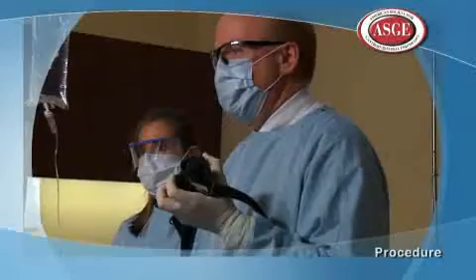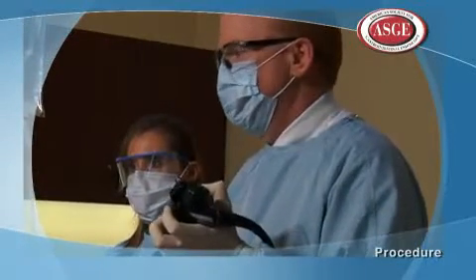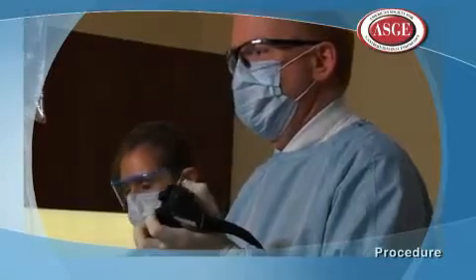Your doctor may also use upper endoscopy to take small tissue samples called a biopsy. A tissue biopsy can help your doctor identify whether the tissue is cancer or not. Biopsies are taken for many reasons, and a doctor might order a biopsy even if cancer is not suspected in order to diagnose certain conditions such as celiac disease or Helicobacter pylori infection.